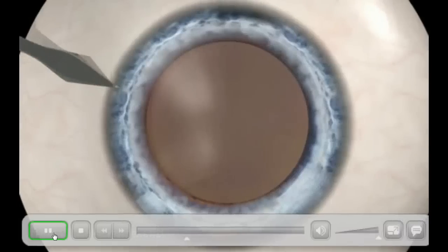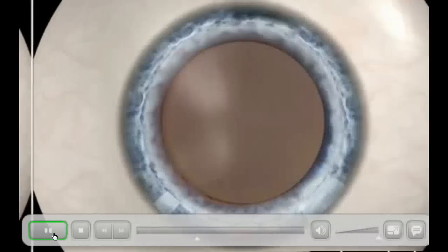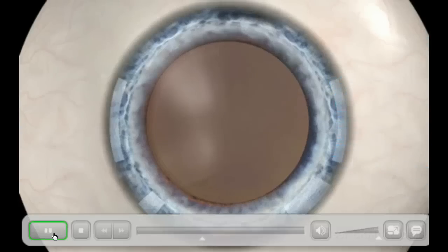If the patient has astigmatism, traditional cataract surgery requires a blade to create arc-line incisions in the outer margins of the cornea to correct the astigmatism. While with bladeless laser cataract surgery, these incisions are performed with the laser.